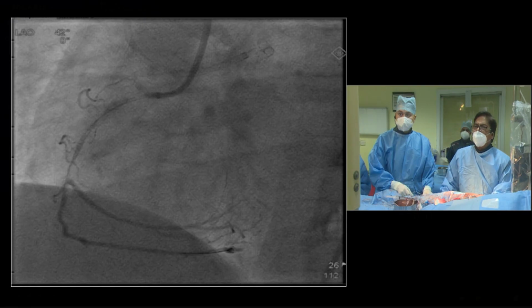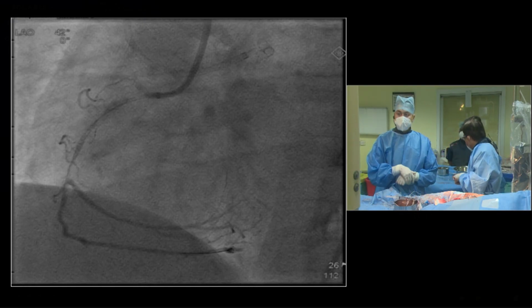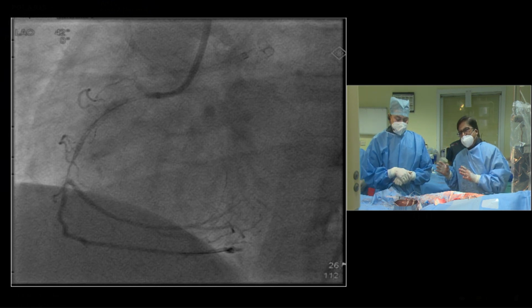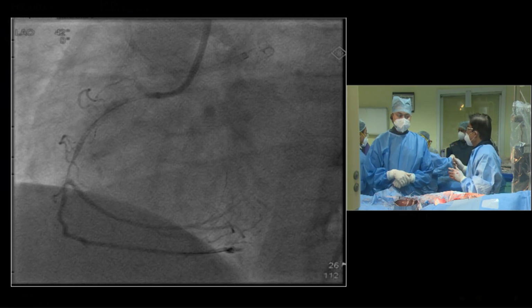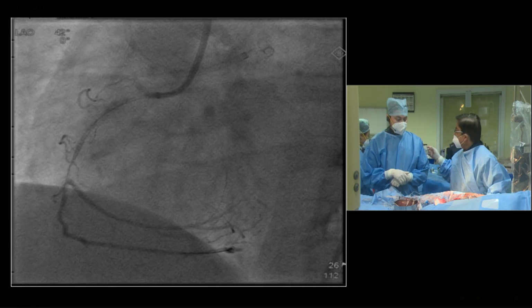Okay. Angio, please. I think, Goel sir, we can try to wire without even a Crusade. Yes, that's what I was thinking. Give me a Sion wire, please. No, but I will just try once, and if it works, you have a Crusade? You don't have a Crusade? No.